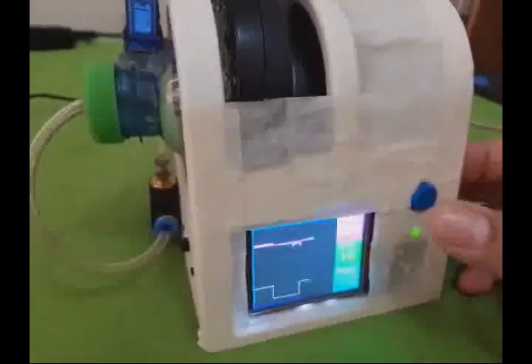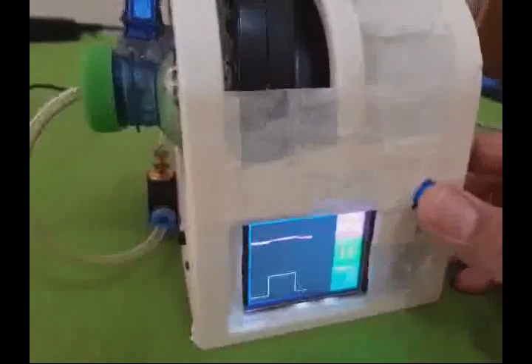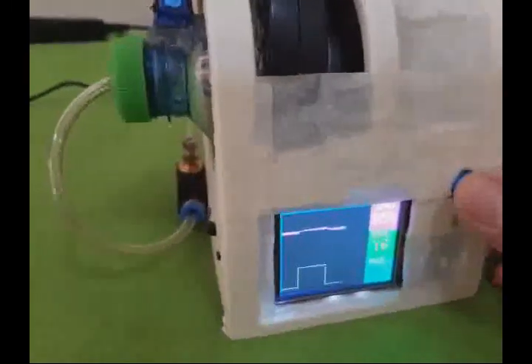You can see exactly the ratio of the servo valve. This is the expansion valve, this is my servo rotational valve, and you can see the split of the block. This is what I wanted to show, how this machine is working.